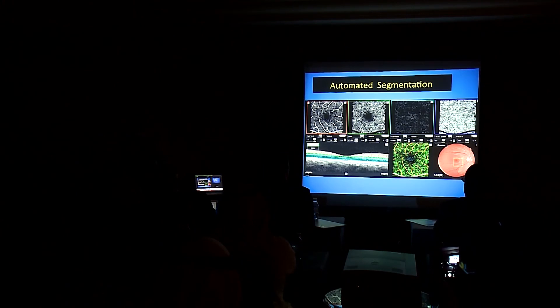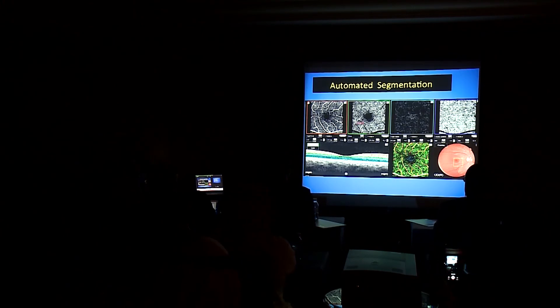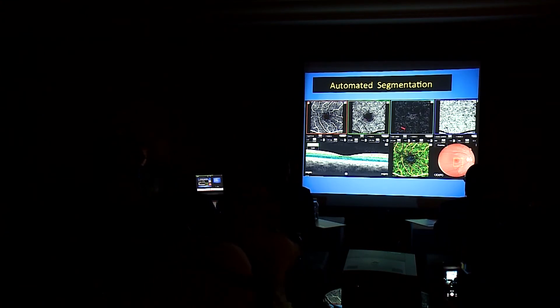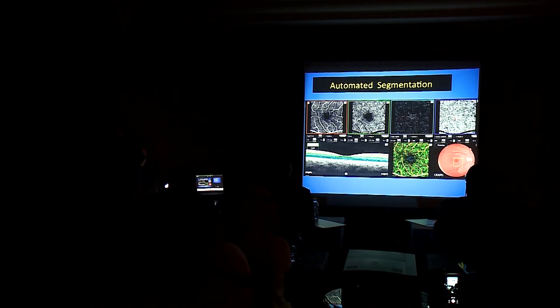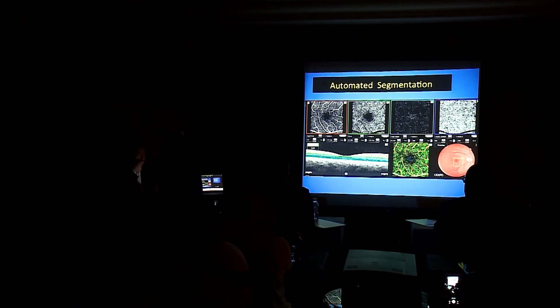The machine gets the signal, decorrelates it, and gives us four layers: the superficial capillaries, the deep capillaries, the level of the retinal pigment epithelium where we don't see any vessels, and the level of the choriocapillaries. Automatically, it is segmented and shown to you after the machine acquires the data.